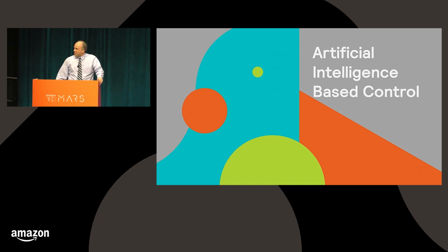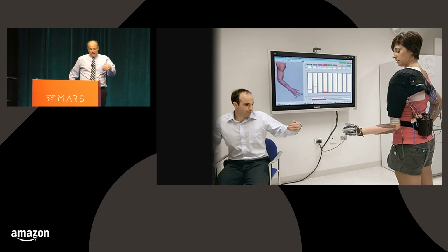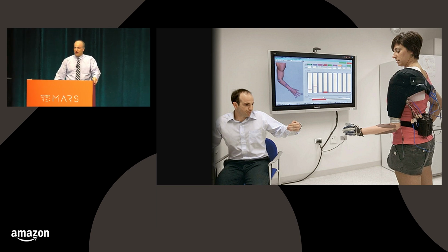I'm really happy to be here to share some of the work that our group has been doing. I'm from the place called the Shirley Ryan Ability Lab, which used to be known as the Rehabilitation Institute of Chicago. And we've spent several years developing intent recognition systems for bionic arms and legs. And similar to Elliott, I'm trained as an electrical engineer, is my background. But I also really had a passion for helping people. And so this is, I'm not in a fancy fire suit, but that is in fact me, working with Amanda Kitts and developing some of the preliminary bionic arm control strategies at the Rehabilitation Institute of Chicago.